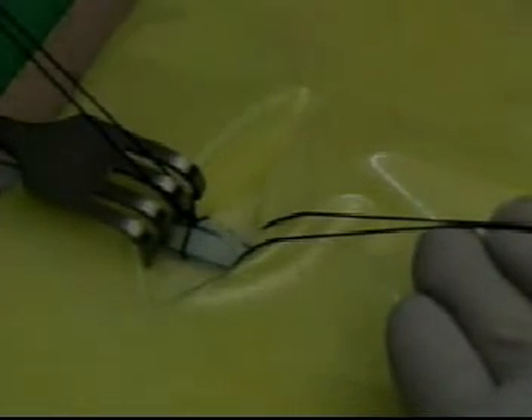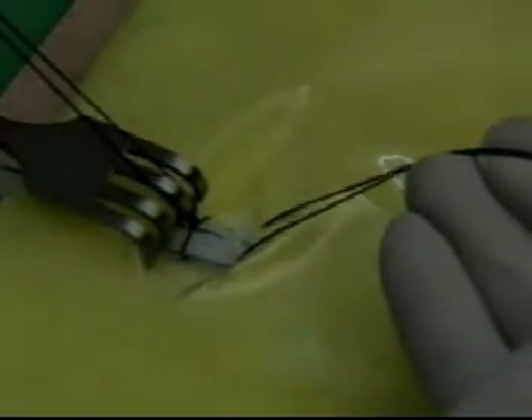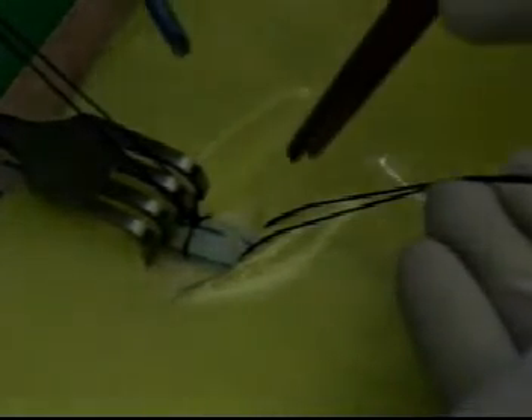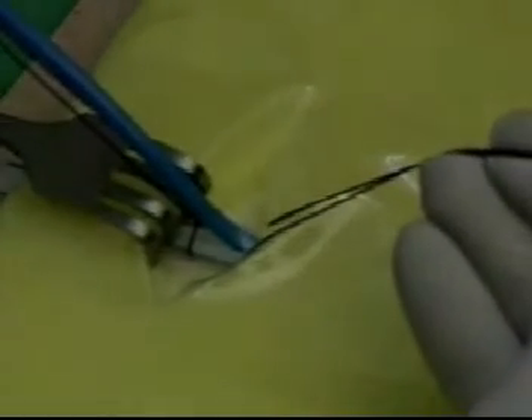A cut-down catheter is then taken and pushed into the vein. When the appropriate length of the cut-down catheter is inside the proximal part of the vein, the proximal suture is also tied.